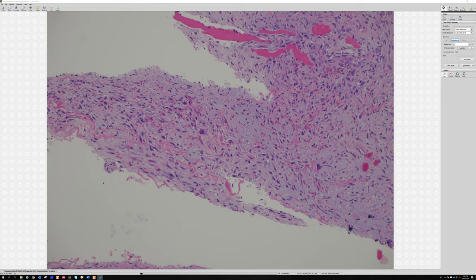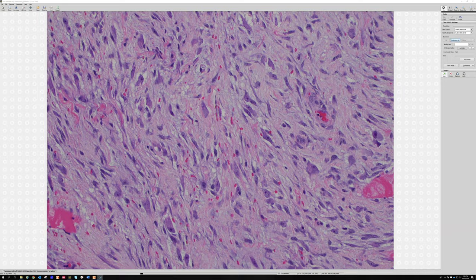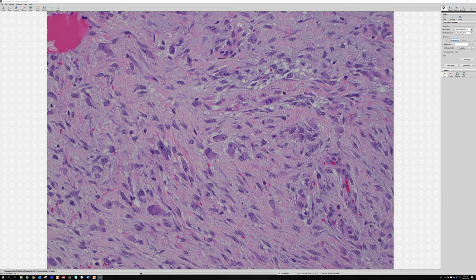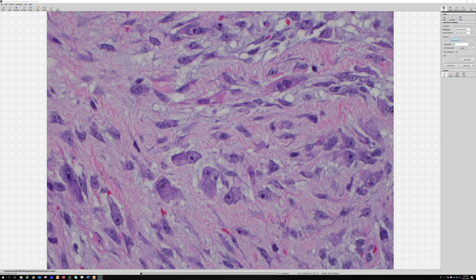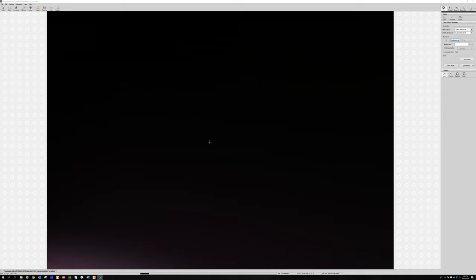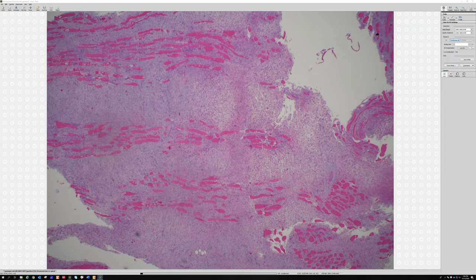It's really easy to get tricked. Here's a good close-up view of the ganglion-like cells — prominent nucleoli, and as described, they really do have a rhabdoid look: eccentric nucleus and abundant purple cytoplasm. Those are the ganglion-like cells of proliferative myositis. If this lesion were not in the muscle we'd call it proliferative fasciitis. It's a really good thing to know about — very tricky and challenging, but benign.